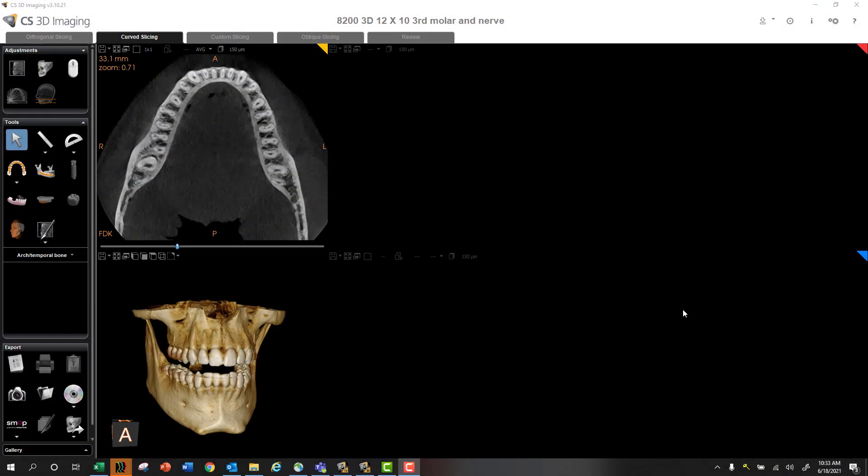Hey, what's going on? This is Phil Leinberger, and I wanted to show you an alternative way to create your panoramic curve for the mandible.